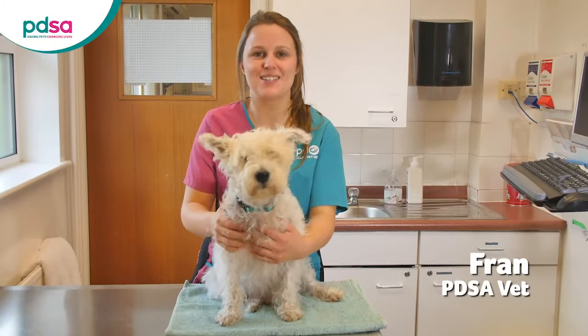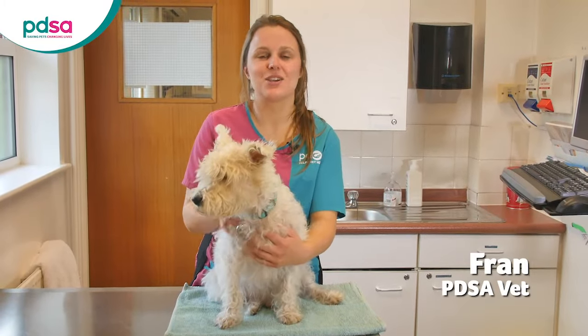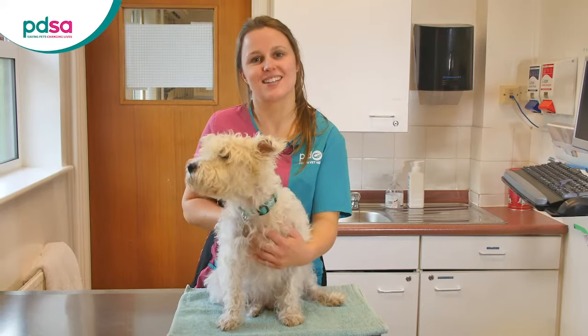Hello, I'm Fran and this is Buster. This video is to show you how to inject your diabetic dog with insulin.